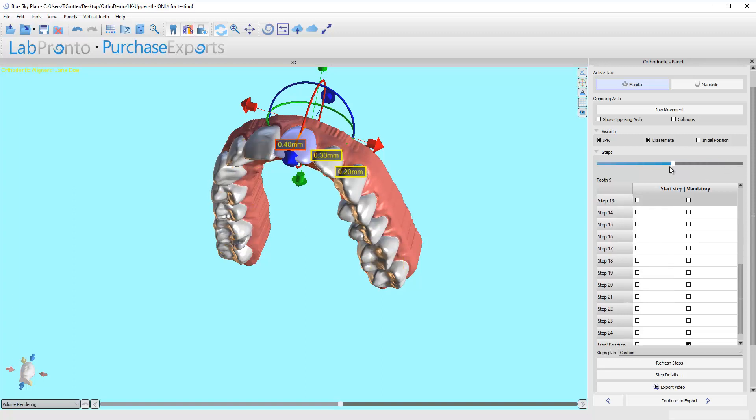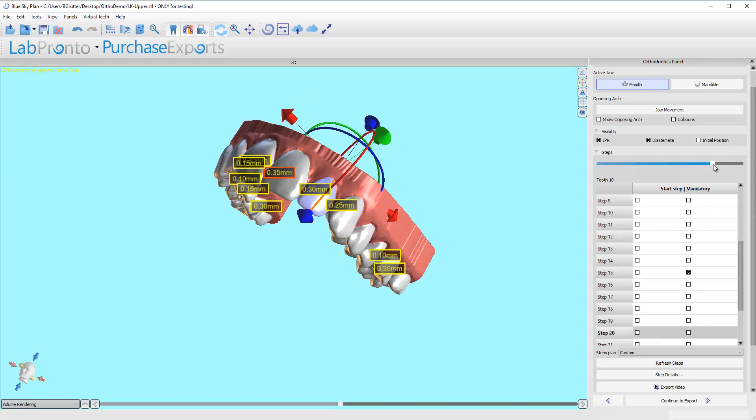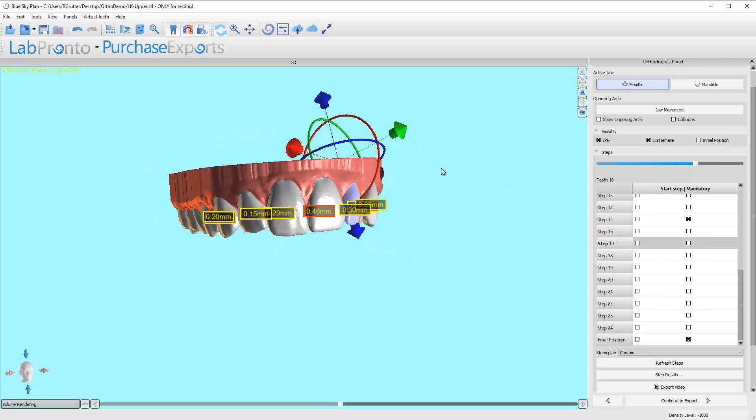As soon as that 0.35 comes into play, I can move this tooth a little bit in the other direction — try to split the difference. I'm going to click refresh steps and see how that improves things. It gets to here and then hovers right in that area, which I think is going to be fine clinically. I've just resequenced the movement a little bit there, and that makes me happy. I think that's going to work.